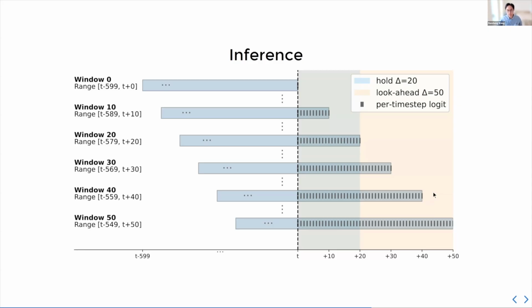There are actually some works that explore that aspect, and I don't have a good answer for this, because the signal picks up both gestures. As I said earlier, if you try to move your arm and open your hand, both signals are in your EMG. A common approach others use is frequency analysis, because some people think that opening is a very short, instantaneous burst, whereas movement is slower.